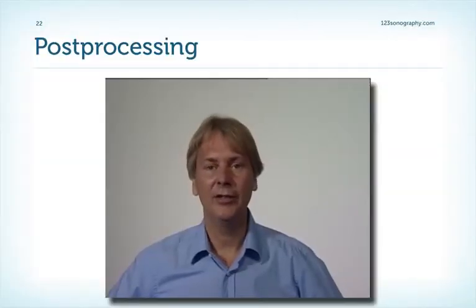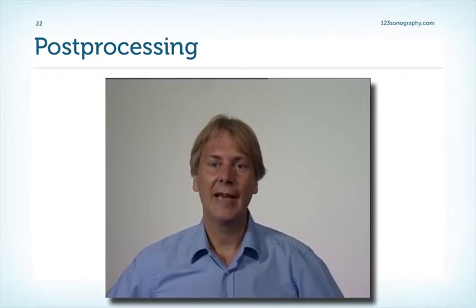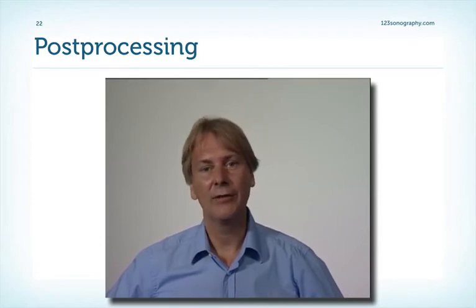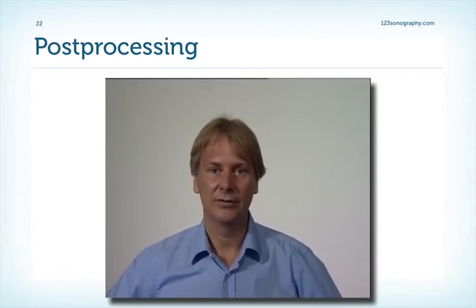Imagine you're on vacation and you take a photo which is very important to you. But unfortunately, the lighting situation is not very good. What to do? Well, you take this photo to your computer and you play around with it with special image processing software, and then you end up with a photo which looks much better than the original photo. Basically, this is exactly what post-processing is. It's taking the information we have and trying to change it and manipulate it in such a way that it appears better for the eye.